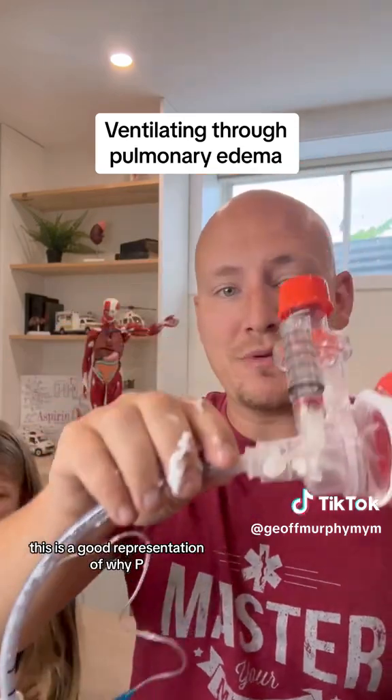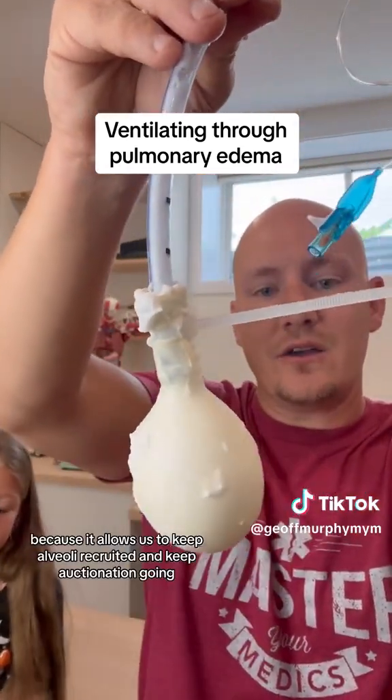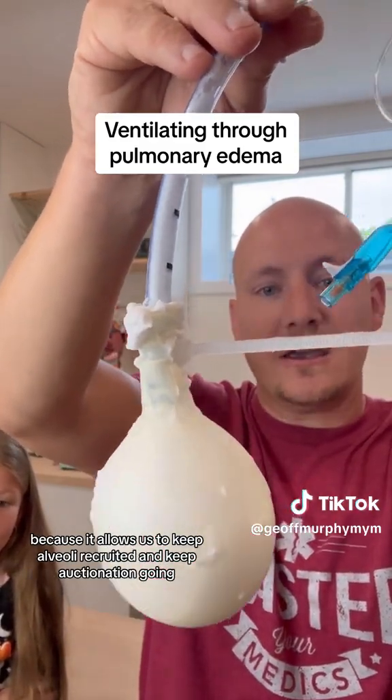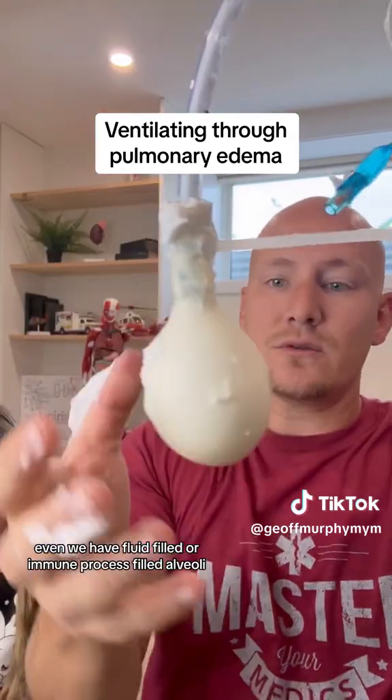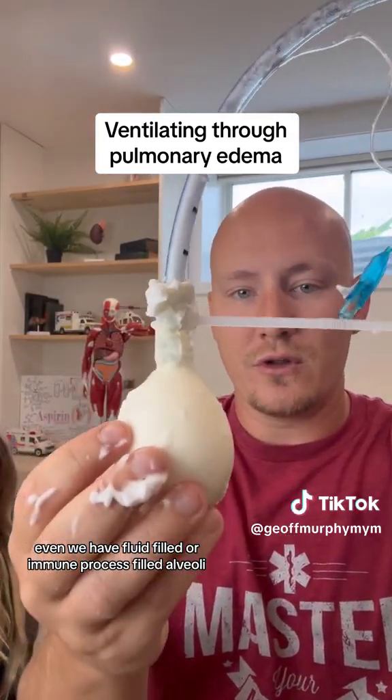Not great because we still have a lot of pathological process in here, but so much better. This is a good representation of why PEEP valves can be so important in pathology like this — it allows us to keep alveoli recruited and keep oxygenation going even when we have fluid-filled or immune process-filled alveoli.